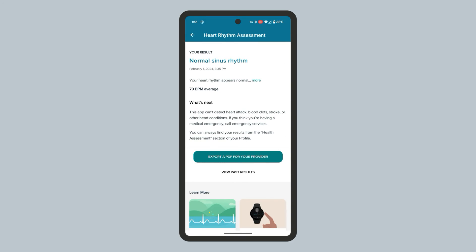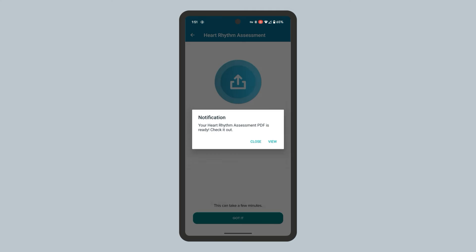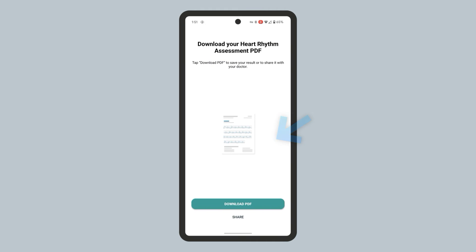At the bottom, tap 'Export a PDF for your provider'. You can tap View in the notification popup. Then select 'Download PDF' to save the PDF to your device, or 'Share' to share the PDF with another app.